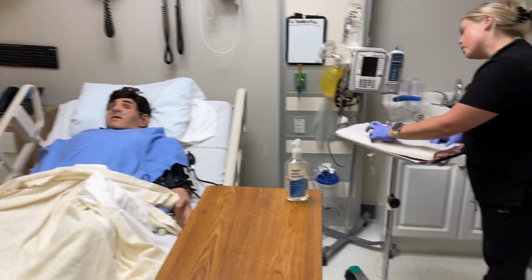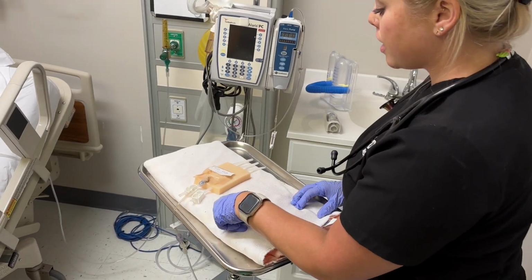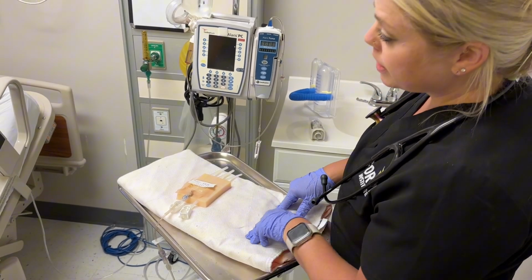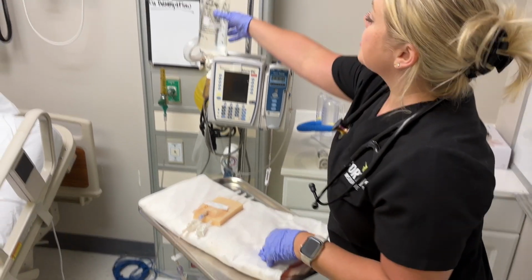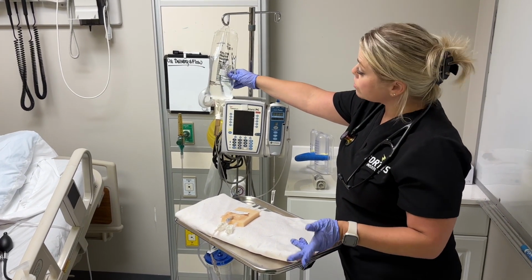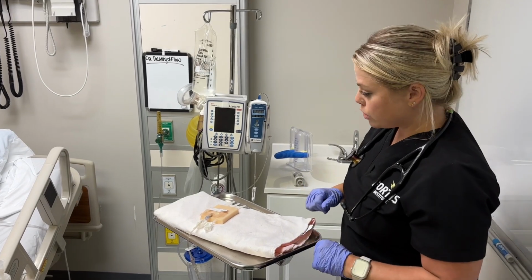So I've got a 20 gauge in the right forearm. It was inserted yesterday. My dressing is clean, dry, and intact. I do not note any signs of infiltration, no phlebitis. Are you having any pain at your IV site? No, I'm not. Okay. And it looks like I do have IV fluids running. So I have normal saline. It is running at 100 mLs per hour, which is what's ordered. And it is not expired. It expires in 12 of 2028.